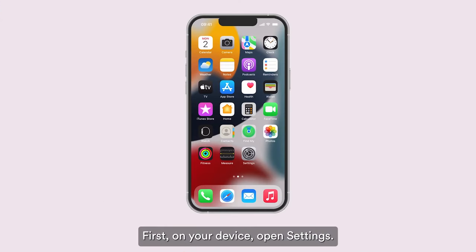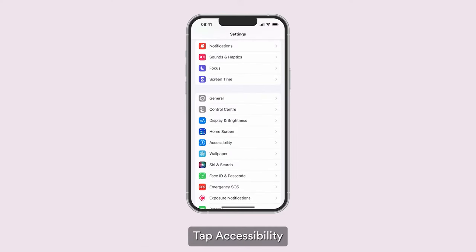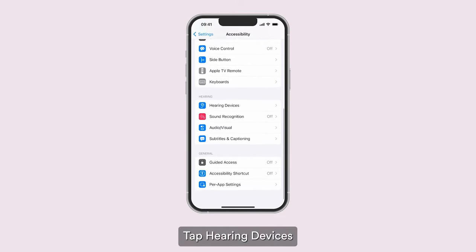First, on your device, open Settings. Tap Accessibility. Tap Hearing Devices.